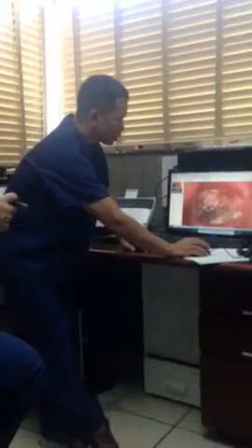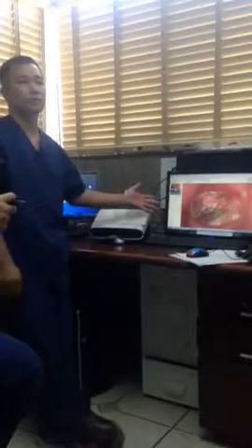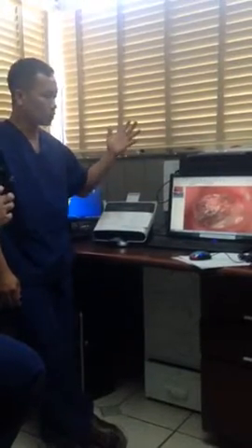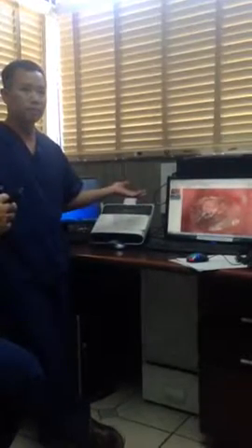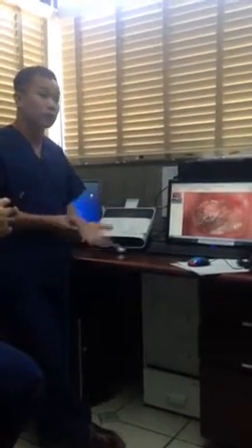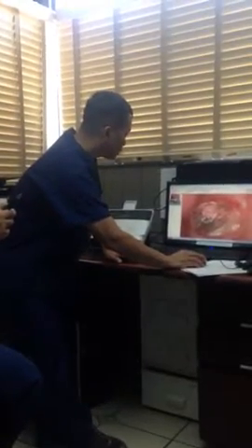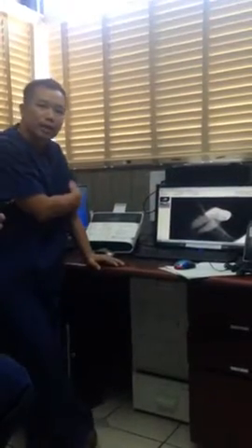Now, in addition, in our office, we take photos of the teeth before we do it. In this particular case, I chose to take the photo of this tooth after this crown fell off. It fell off as I was trying to do the root canal. Looking at this type of x-ray here, I have no idea that that's going to happen. As a matter of fact, I don't see any decay in here. Why? Because the crown is covering all that decay that we just saw in that last photo.